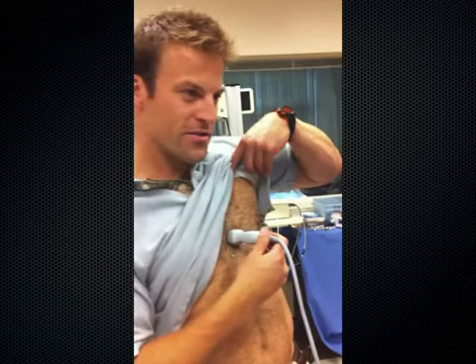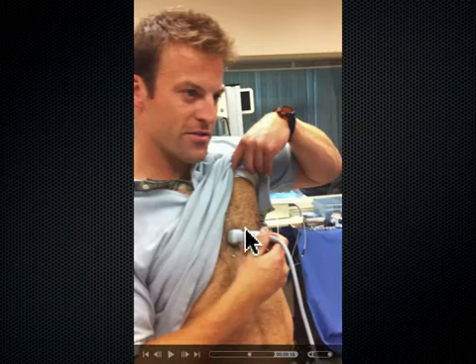So that's Eric Mervis. He's one of our residents in the emergency department, and when I first saw him do this, I thought, wow, does he just have really wide-spaced nipples? Because look how far apart the probe is from his nipple. But he doesn't. I looked for a web neck and other signs of chromosomal abnormality. He doesn't. All he has here is, it's because he's standing up, and the heart shifted in his chest cavity a little more medially.